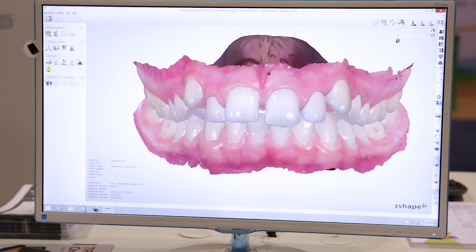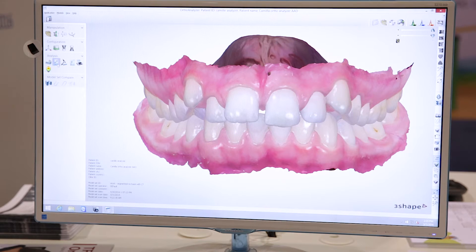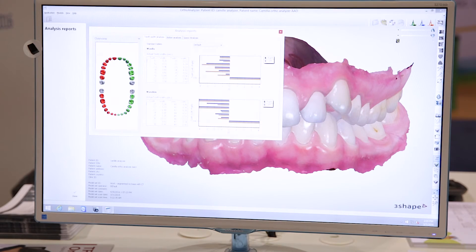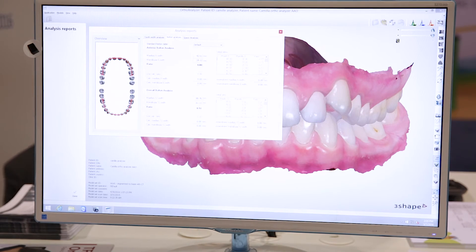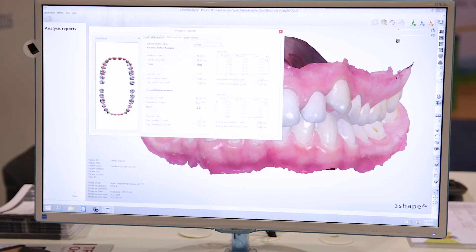It also comes with a number of analysis tools. You can do quick things like Bolton analysis that you probably use in your practice already today. The system knows exactly the width of each tooth, so stuff like Bolton analysis and space analysis simply come out of the box with the system.